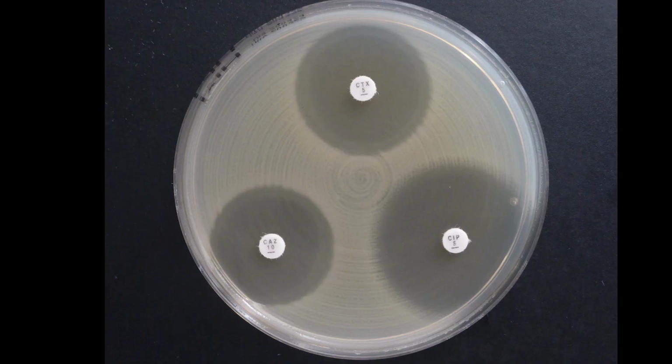You should also talk about how to read plate zones from Mueller-Hinton and MH-F plates. For Mueller-Hinton plates without supplements, you read zones from the back of the plate, and it should be against a dark background. For the MH-F plates, you have to remove the lid and read from the front. For MH-F, it's not specifically stated, but in our experience, it's always better to have a light background and not a dark background, because it's easier then to see the difference between growth and no growth.